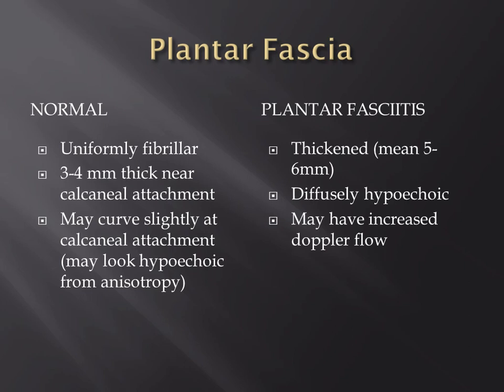If it's thickened to 5 to 6 millimeters, diffusely hypoechoic, or increased Doppler flow, those are findings that would suggest plantar fasciitis.